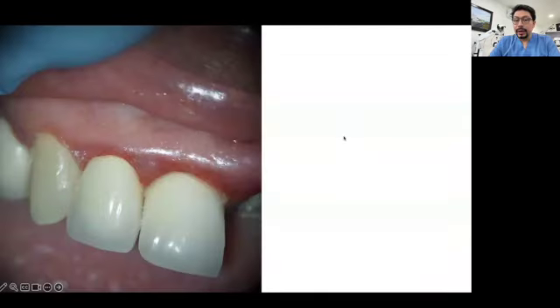in our daily routine. Let's talk about the communication between referrals and the endodontist. This is an interesting case because the referral doctor asked me to do a root canal treatment in the lateral incisor and in the central incisor. And the referral told me, Jenner, you know, we just placed the crowns. The patient is in pain. And please do the root canal treatment.